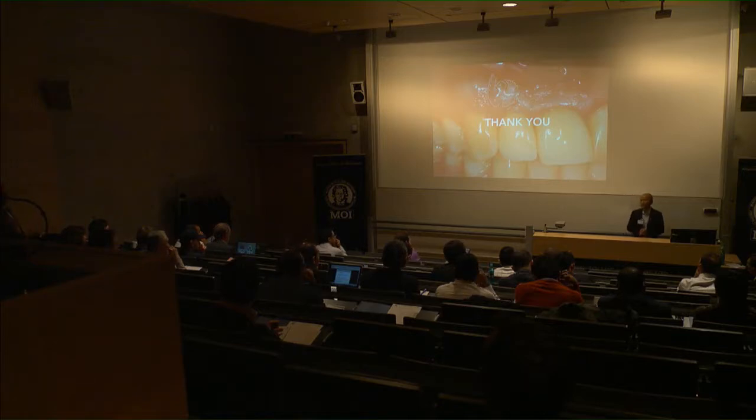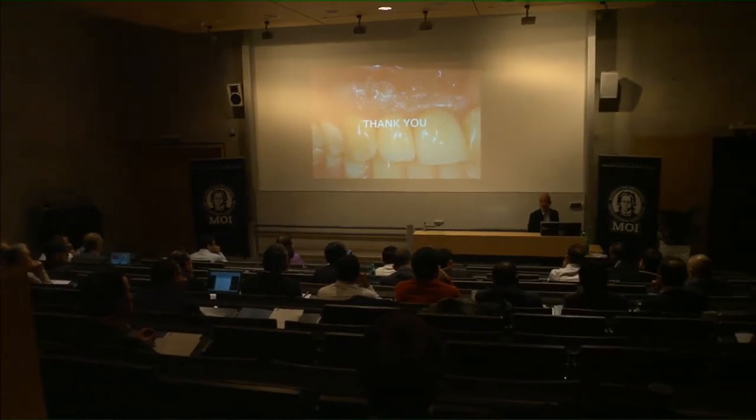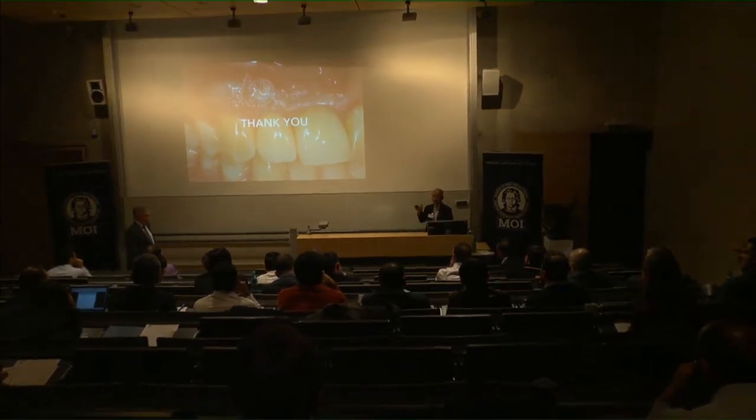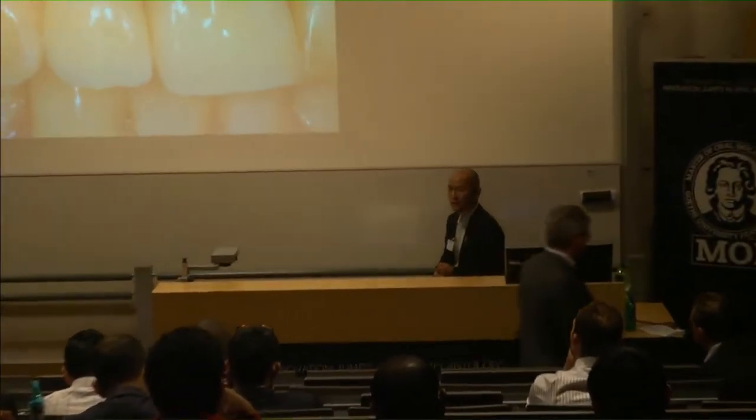Thank you. Yeah, that is a very important issue. If you push on the shield, you would have a pressure. It's like a natural tooth, and we don't know the consequence. You can have bone modeling to change, like an orthodontic movement, or if you push it too hard, you will lose it. So we don't want to do that. So when you do that, you have to make the profile very, very flat to avoid this. You should have at least 0.5 millimeter of soft tissue to grow over. Otherwise, you have an exposure of the shield.